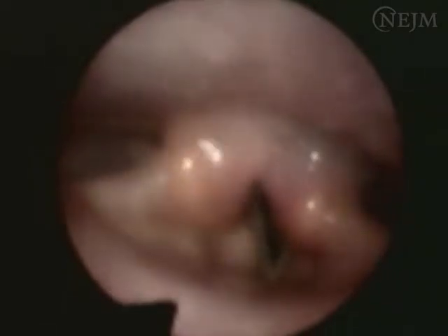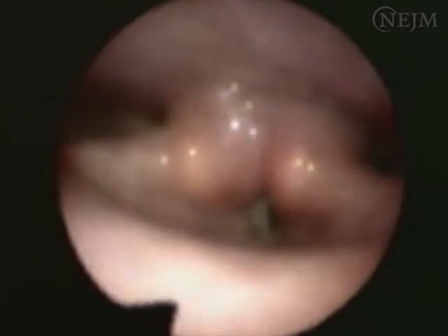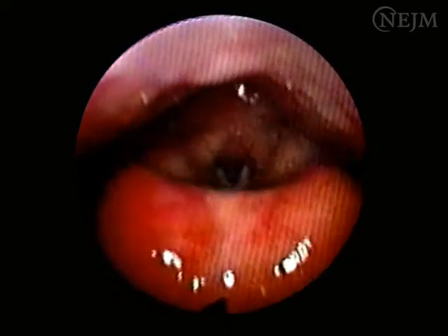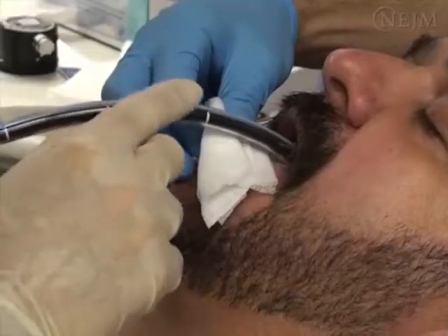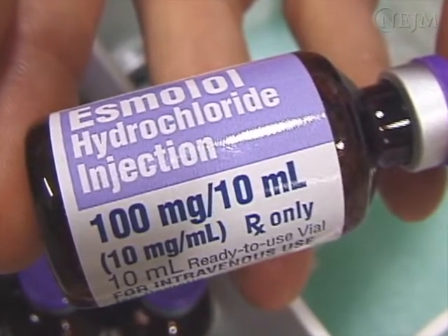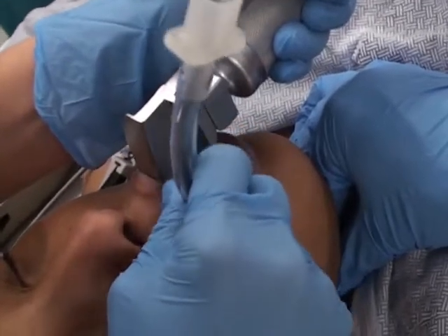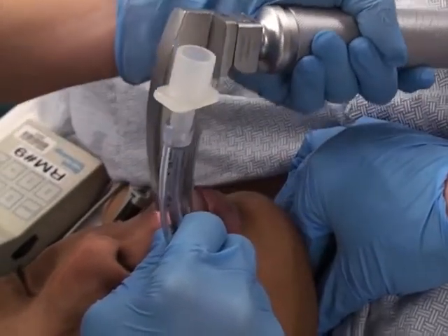Vocal cord dysfunction is a rare cause of airway obstruction and, if present, may require immediate re-intubation. Suspect vocal cord dysfunction if the team thinks that the recurrent laryngeal nerves might have been injured. Patients with laryngeal edema due to prolonged intubation or direct glottic compression can present with delayed airway obstruction and inspiratory stridor. Impaired airway and swallowing reflexes can pose a risk of pulmonary aspiration. Manipulation of the airway is usually noxious for patients, causing increased myocardial demand. Pre-treatment with opioids or beta blockers can reduce this catecholamine-mediated stress.